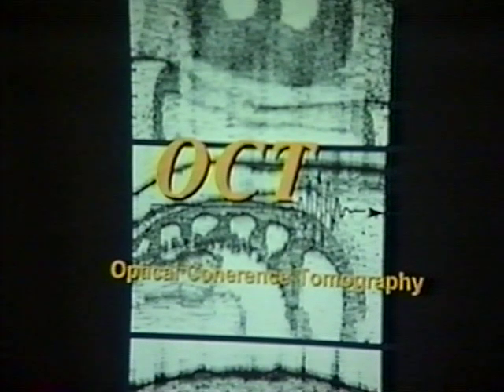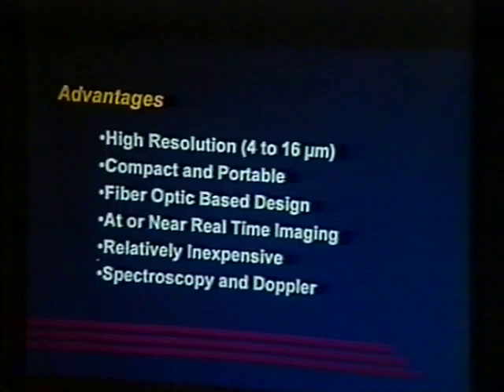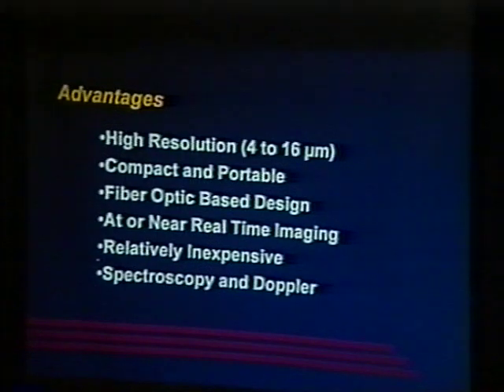So today I'd like to talk about a new method of high resolution imaging referred to as optical coherence tomography, or OCT. I'd like to begin by discussing the principles behind OCT in a very basic way, and then go on to some of its applications, then move on to the technology, and finally discuss some of the limitations and future efforts.